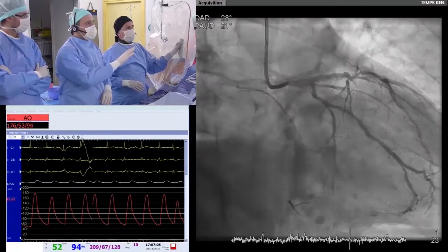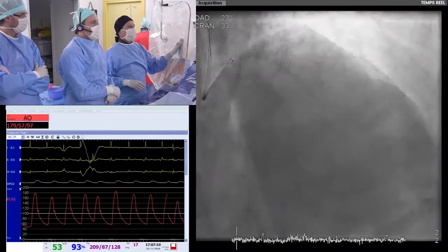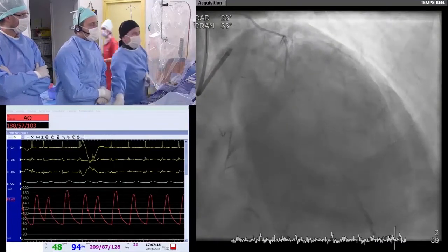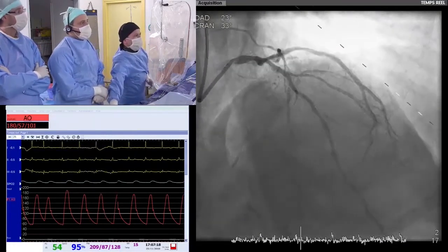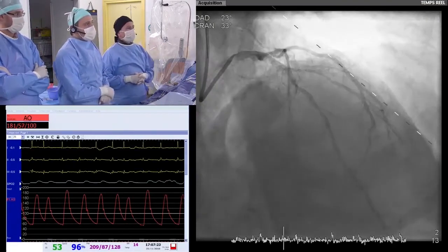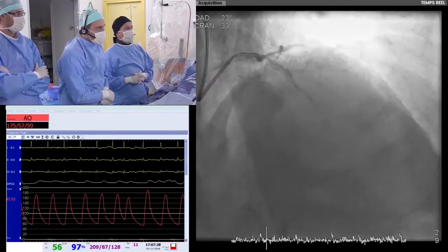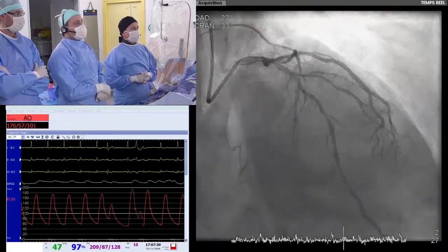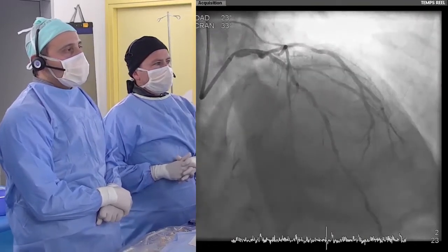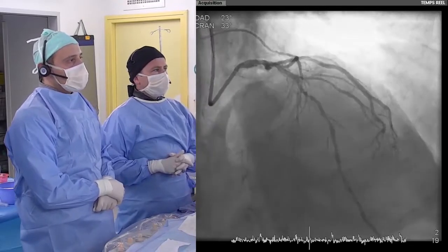You see lots of calcium here, but the point comes when we see a cranial angio, cranial view. There you go. With the empty coronary artery, at the beginning of the injection, you can appreciate already at the fluoroscopy the amount of calcium that is present in this vessel, from top to toe actually. And you can also understand what could be the issue behind this dampening of pressure. There is indeed an ostial left main stenosis there that was not at all looked into at the time of the diagnostic procedure.